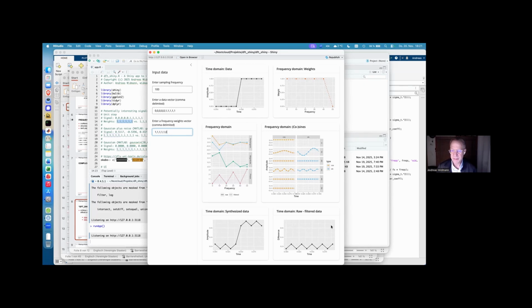That is, this part is a constituent part in the frequency domain of that broadband signal. It's simply there. Even if it's not related to the generation in the time domain, it's there in the frequency domain. We need it to represent that signal in the frequency domain. And if we remove it, that possibly has consequences in the time domain. And if we have a noisy signal, it's sometimes hard to detect this kind of artifact.